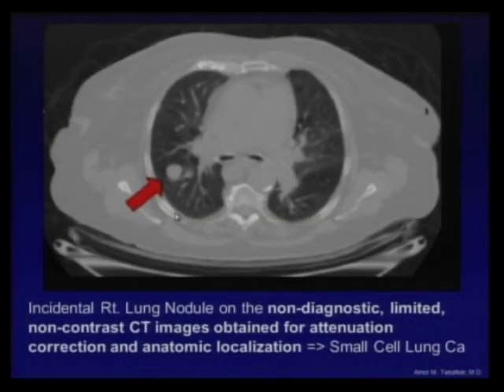It's a CT scan, we get a few slices. Bad luck, you might miss a lung nodule. So take a look at the CT in the lung window as well. It's happened. I mean, I'm showing you a case, so it's happened. And then that's a loss.